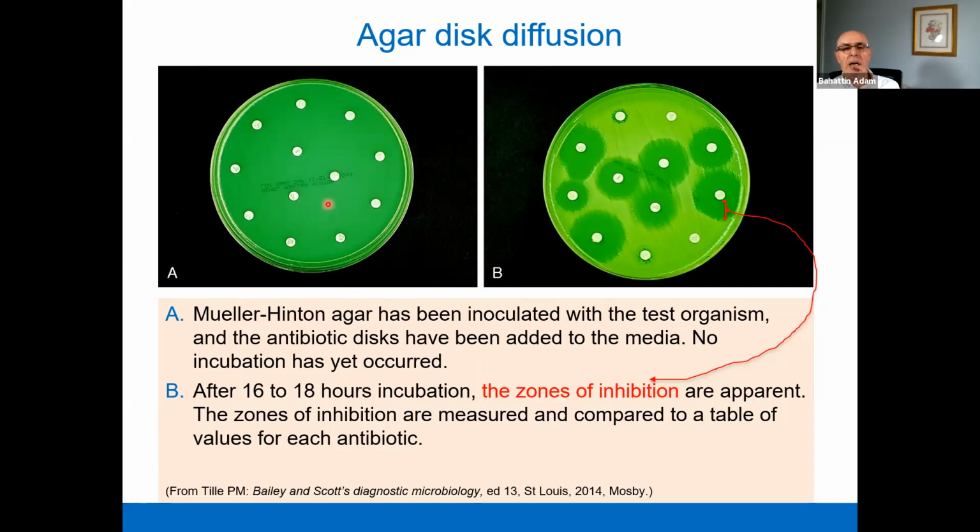No incubation has yet occurred here. This media contains the microorganisms, and then you place the antibiotic discs on the media, and then you incubate this plate in an incubator for 16 to 18 hours.